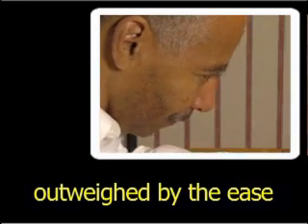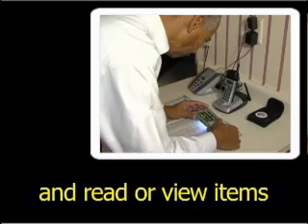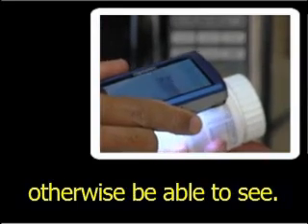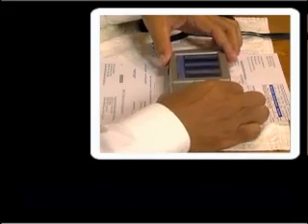However, this difficulty is outweighed by the ease with which you can take this device to any location and read or view items that you would not otherwise be able to see. Users enlarge a vitamin bottle label, a page of text, and a phone book.